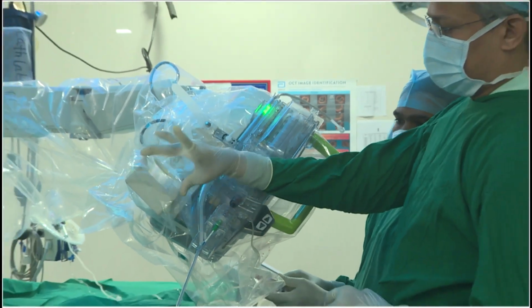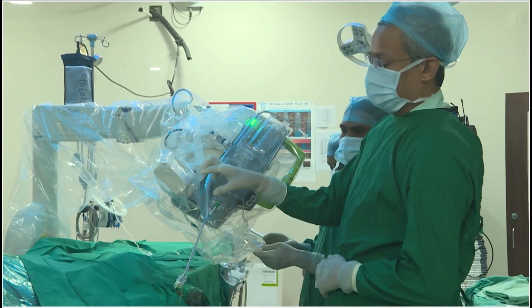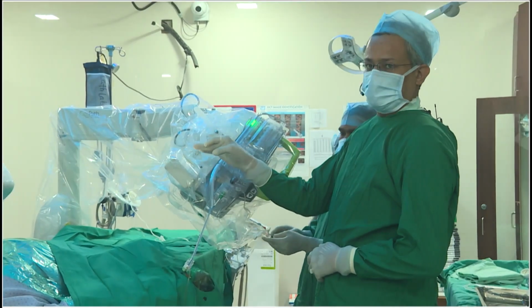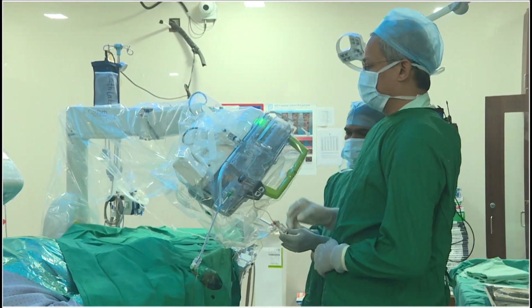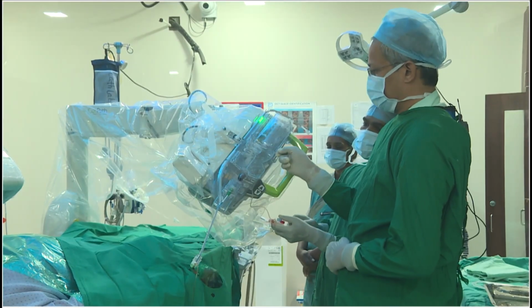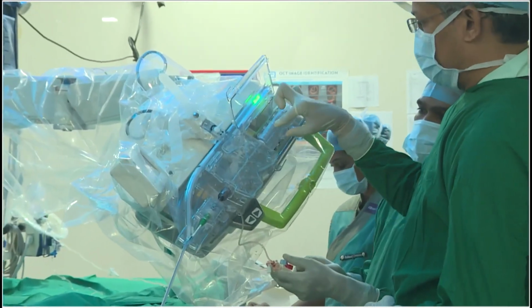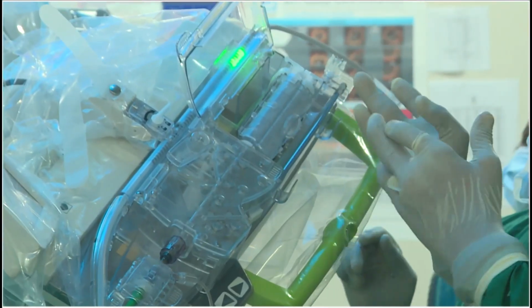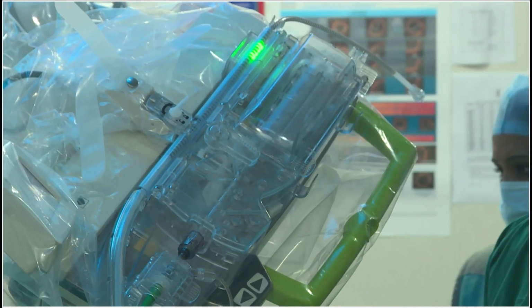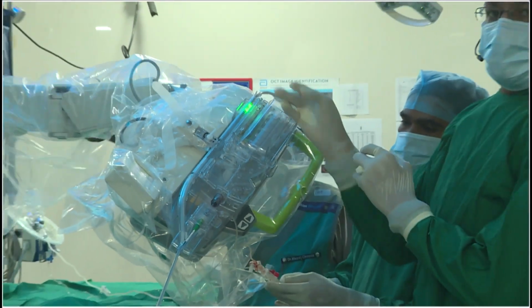There is information here. If you want to exchange any wires, guide wire, we have to press the button over here like this. So the machine prepares itself for putting the devices, right? Now we can just put the wire accordingly, right? So we'll now engage the JR wire robot guidance, right?